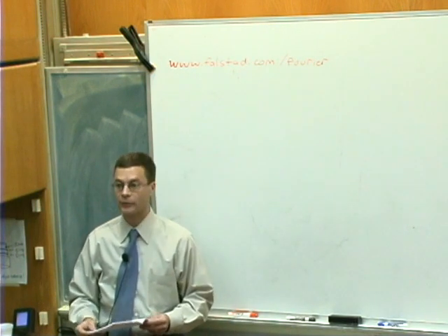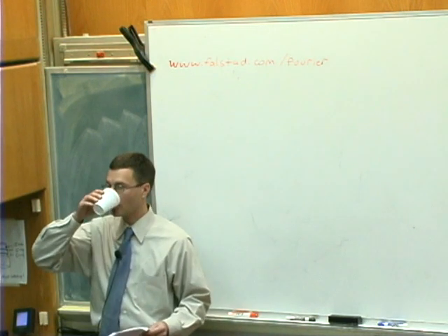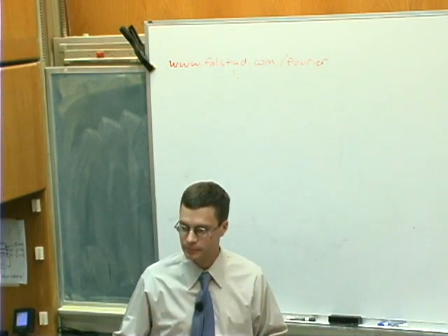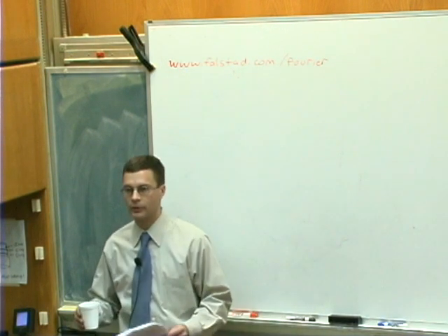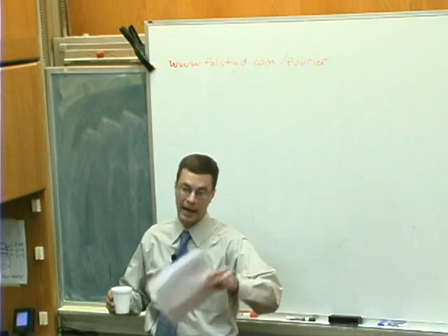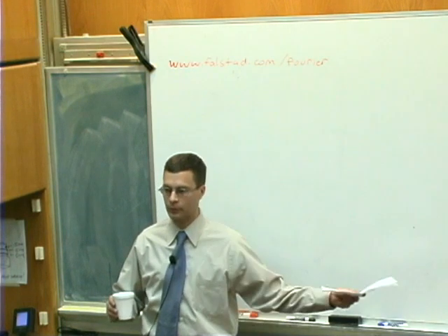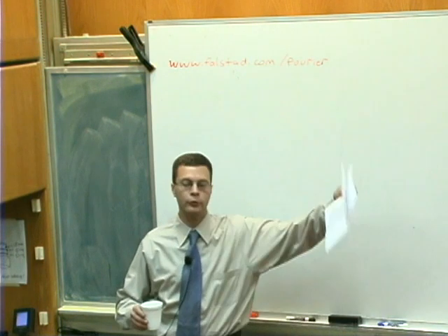Okay. Yes. So this 1 over f is about what you're measuring and not necessarily how fast you're measuring? It's not that the error is in the sampling rate, but in what you're actually measuring, the frequency changes of the actual response? Let me try saying this. I don't know if I fully understand the question. The 1 over f noise means that there are patterns of variation in the signal in BOLD fMRI data which tend to have a lot of power at low frequencies. So the BOLD fMRI signal is changing in a big way, slowly over time.